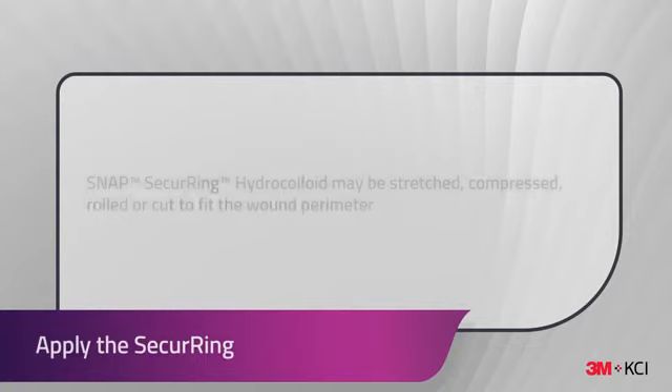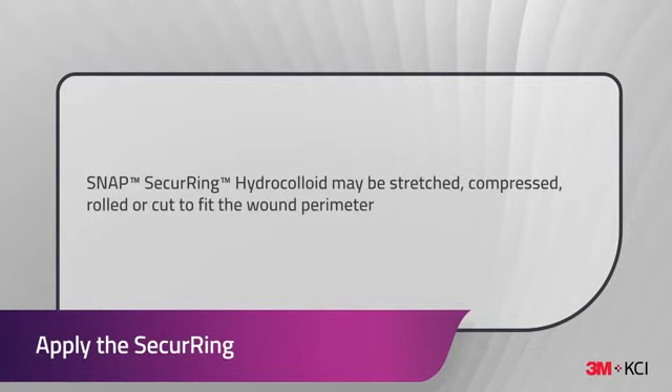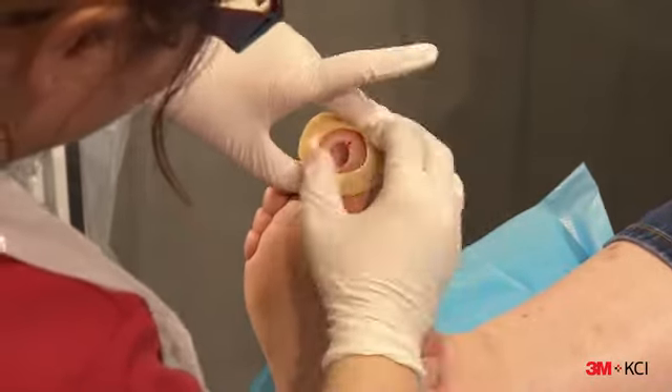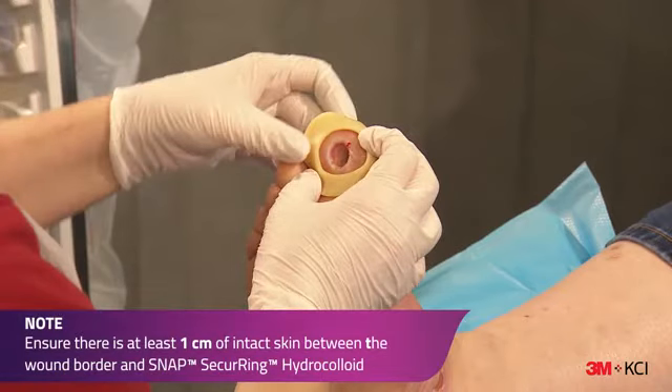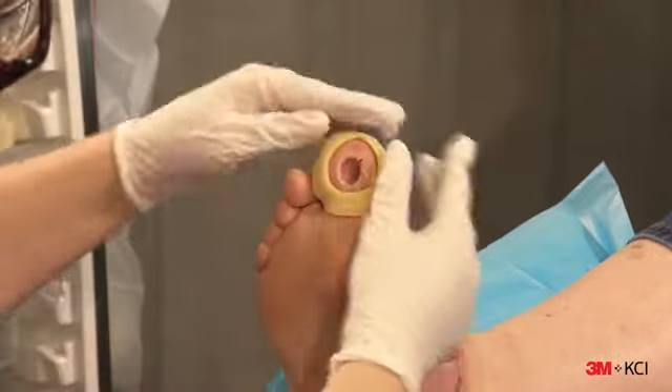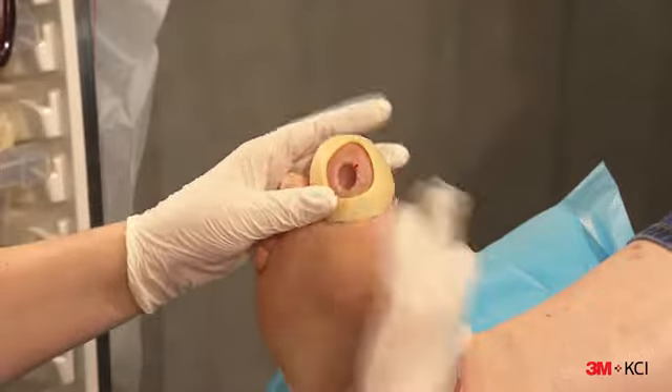Shape the hydrocolloid to fit around the outside of the patient's wound. Using light pressure, apply the Snap Securing Hydrocolloid around the wound. Ensure there's at least one centimetre of intact skin between the wound border and the Snap Securing Hydrocolloid. Do not place the hydrocolloid directly into the wound.